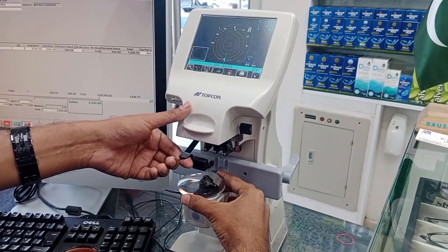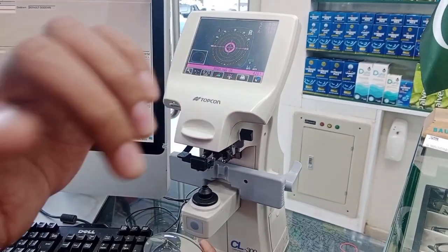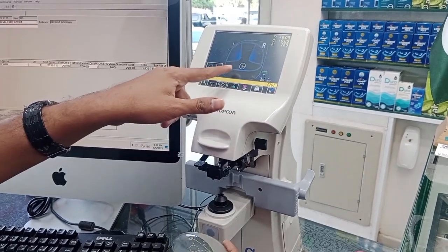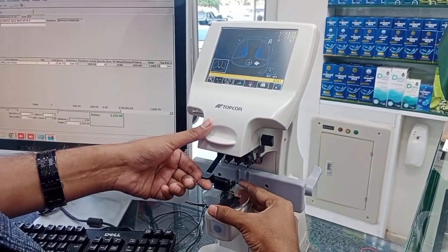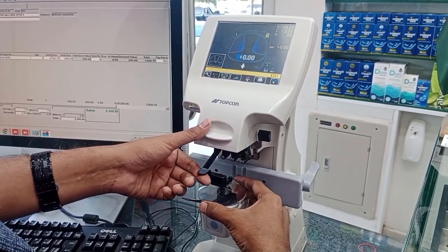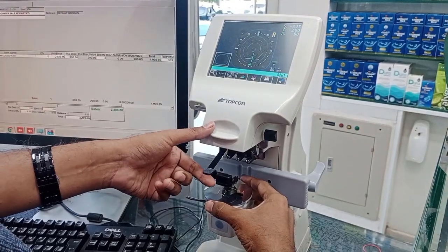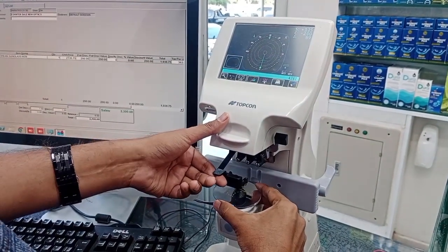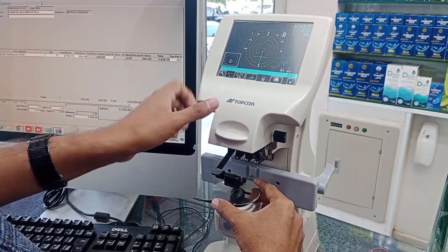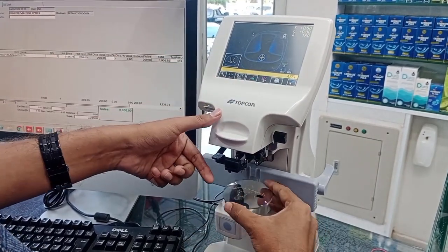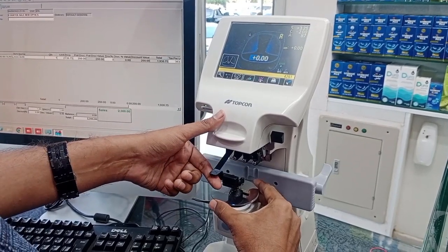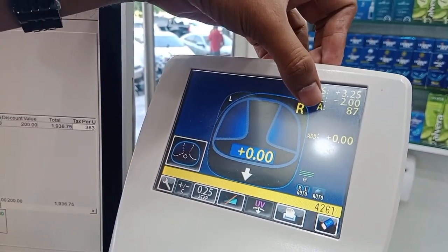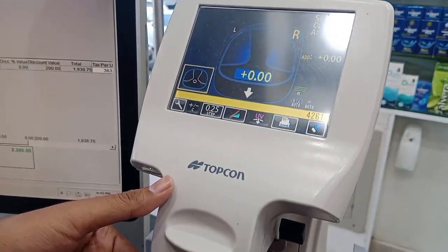I will place the progressive addition lens beneath the lens holder. First, I change the setting from single vision to progressive. The lens is placed and the plus sign is visible on screen. I change the setting to progressive addition lens mode. On the screen you can see: plus 3.25 spherical with minus 2.00 cylinder, axis 87, approximately 90 degrees.